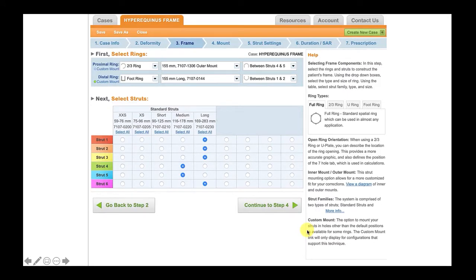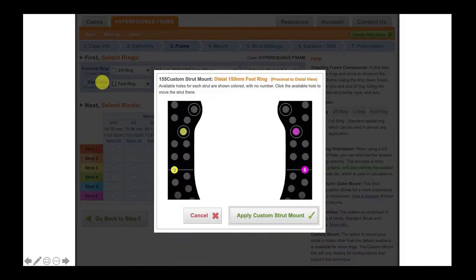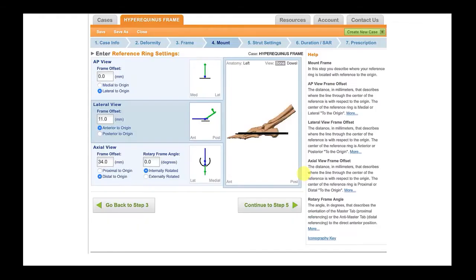On the distal ring, you see this little thing that says custom mount. If I click that little radio button, it turns green. Then I get this dialog box and I get the chance to say where I put the number 3 and number 6 strut. So the next panel that we have to deal with here is the mounting parameters.